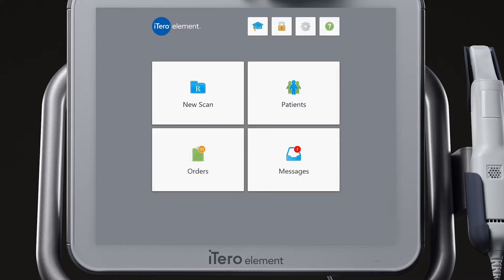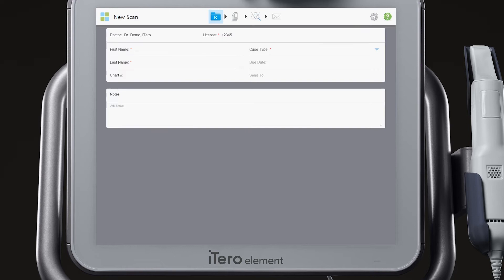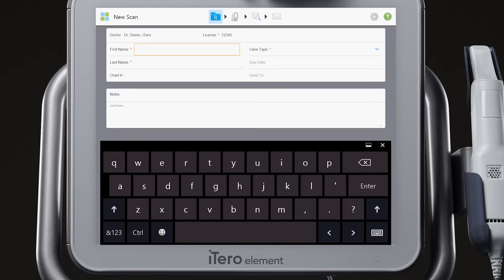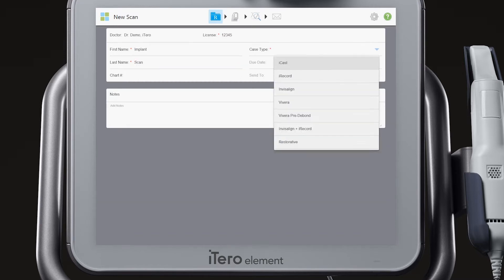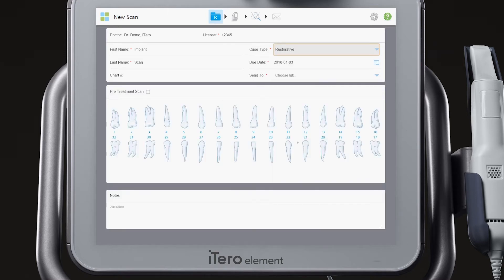To start, select New Scan from the home screen. Complete the required information in the Rx: patient's first and last name, case type, due date, and the lab the case will be sent to. The required items are identified by the red asterisk.